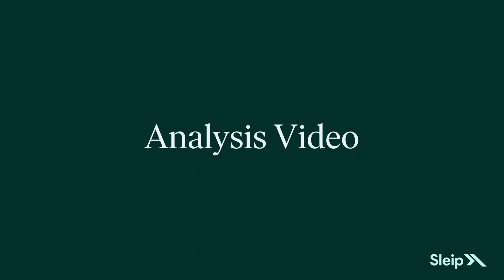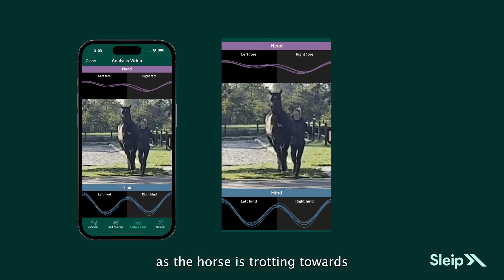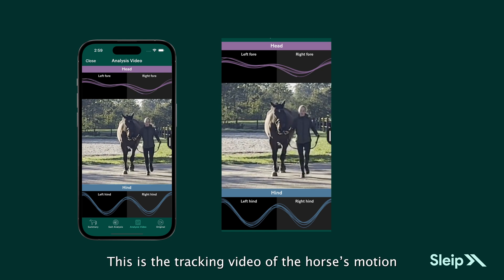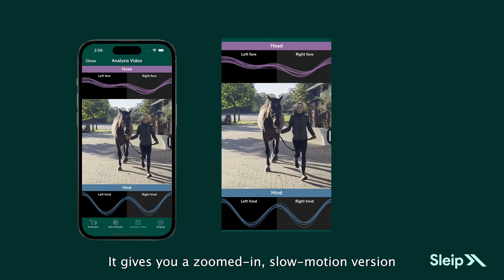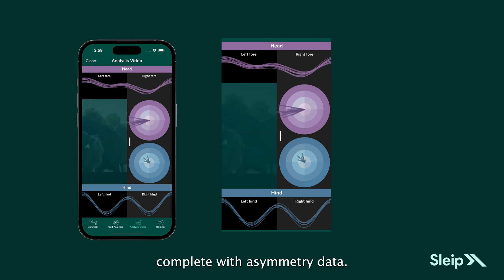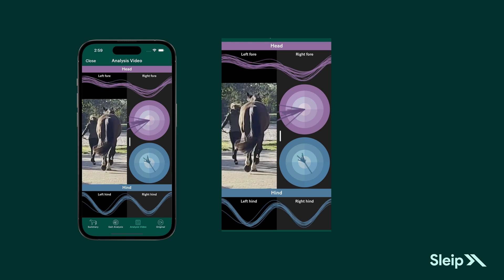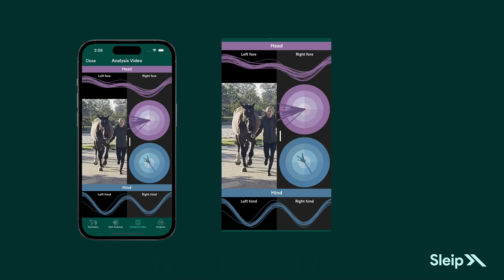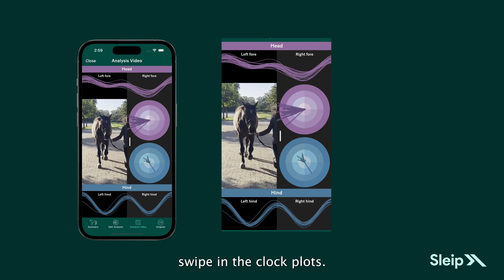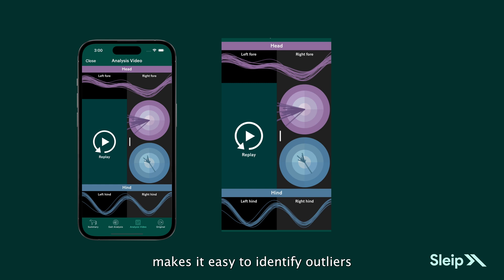The Analysis Video View synchronizes the recording of the horse with the biomechanical tracking as the horse is trotting towards and away from you. This is the tracking video of the horse's motion on which the analysis is based — a zoomed-in, slow-motion version of the original video, complete with asymmetry data, useful for documentation and as a support to visual assessment. The lines shown indicate vertical displacement of the head and pelvis stride to stride. If you want to see exact stride-to-stride information, swipe in the clock plots, which are synchronized with the horse's movements, making it easy to identify outliers and assess their relevance.